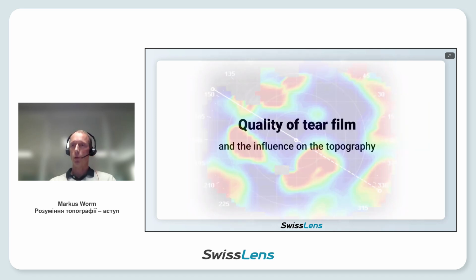When we talk about topography, the quality of the tear film and its influence on the topography is very important. It's a well-known topic in theory, but often ignored in practice. The influence of the tear film on the outcome of topography is a very important fact, and that counts for every topographer that is based on reflection, meaning mainly Placido ring systems. So the quality of the tear film, like a local breakup of the tear film, will influence the topography.